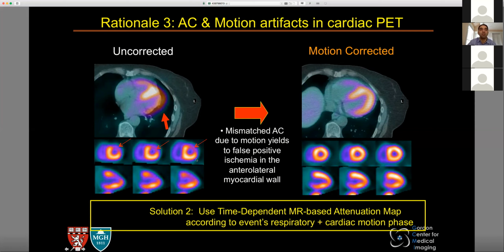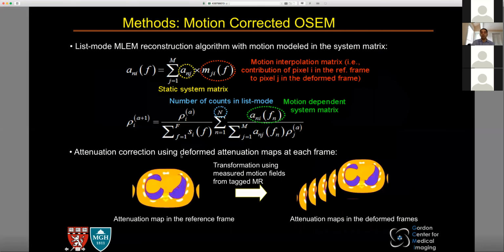This means you have ischemia. They're going to take you to the cath lab. This, you're fine, you can go home. So as a patient, you can think about the difference that there is between this and this. It's huge.